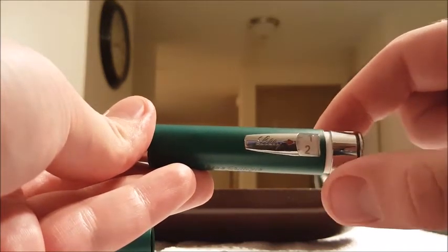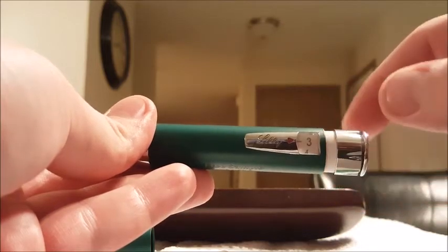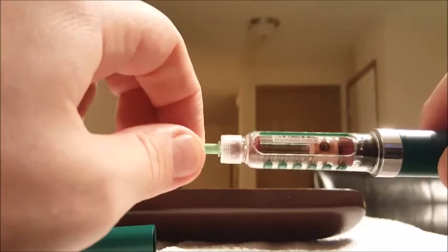It goes by half increments. And when it's ready, take off the green.